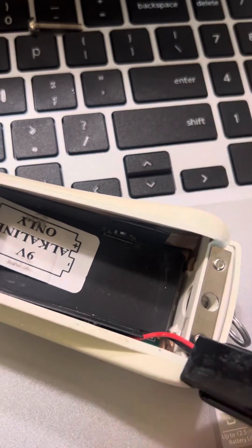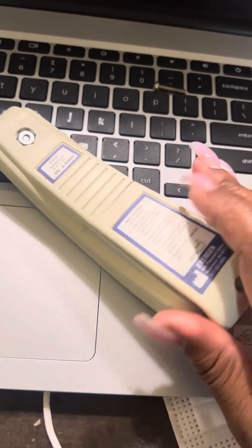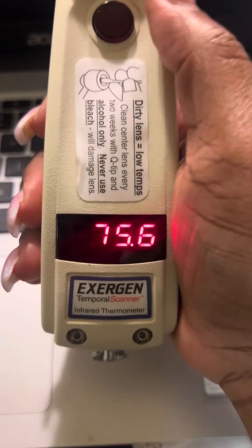I switched it to on. Let's put the battery back in, put the top back on, and let's see what it will do now. And there we go — now it's reading Fahrenheit.